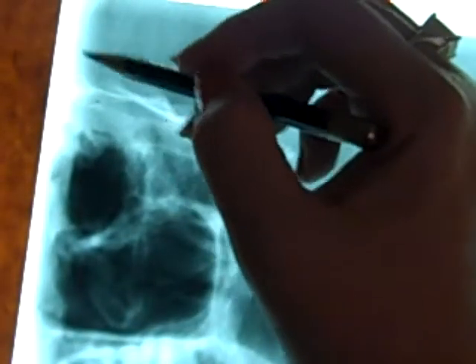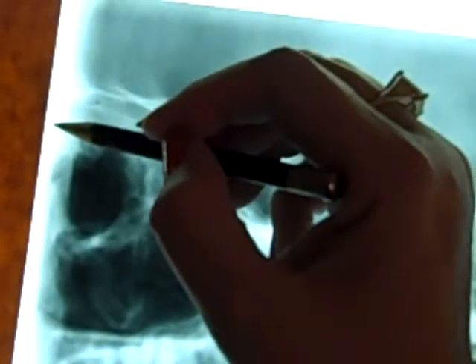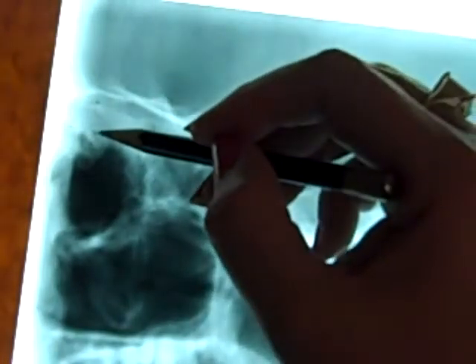Now, a lot of films, including the one that I use in the labs, have a huge frontal sinus right here. So don't confuse the frontal sinus with the eye orbit. Eye orbit, maxillary sinus, and there'll usually be a frontal sinus up in this area. Now, this person doesn't seem to have a huge frontal sinus at all, and so I would line up level with the top of the eye orbit. In fact, I even tell my students that if you can't see the frontal nasal junction, the top of the eye orbit is a good alternative.